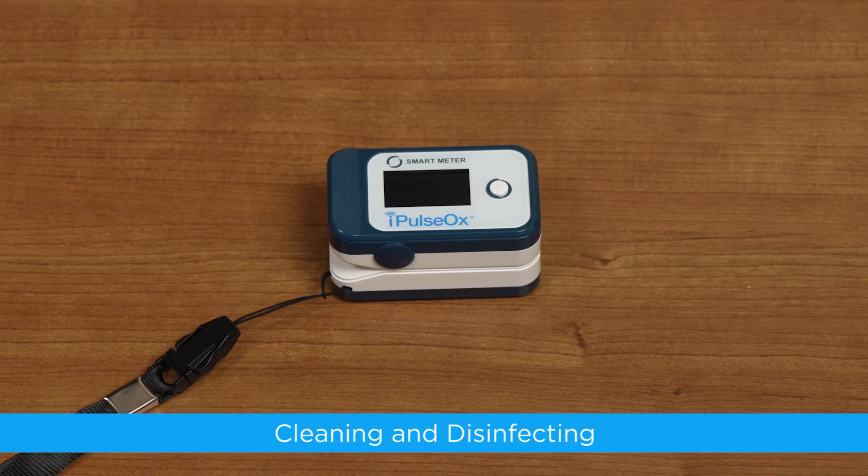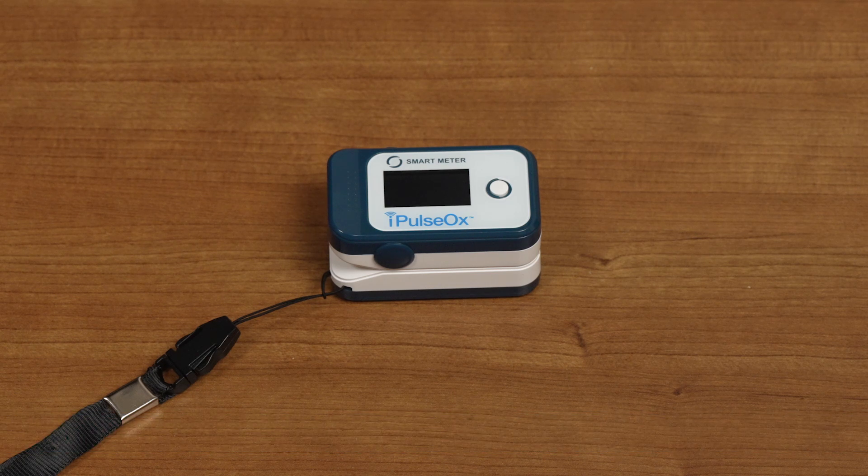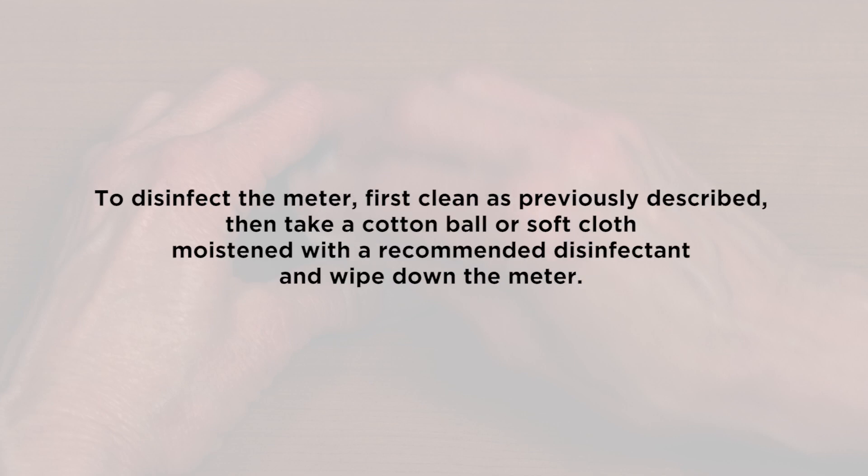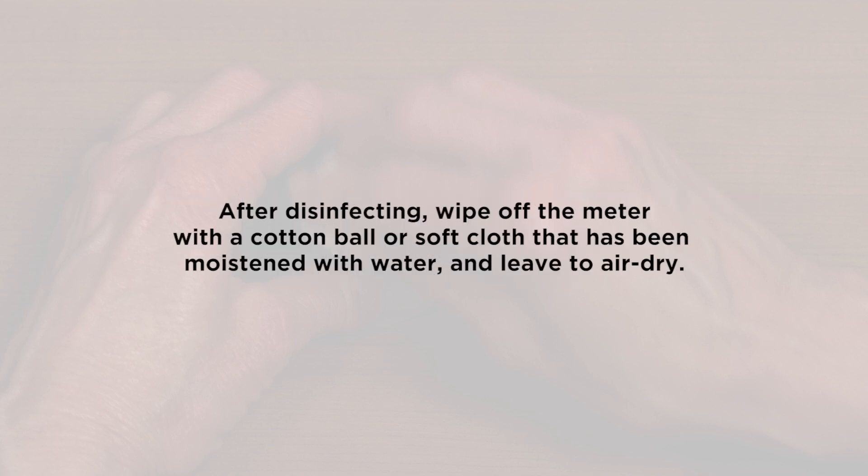Cleaning and Disinfecting. When cleaning or disinfecting your I-Pulse Ox, do not immerse the meter in water or disinfectant. Clean the meter with a cotton ball or soft cloth. After cleaning, dry the I-Pulse Ox with a soft cloth or let it air dry. To disinfect the meter, first clean as previously described. Then, take a cotton ball or soft cloth moistened with a recommended disinfectant and wipe down the meter. After disinfecting, wipe off the meter with a cotton ball or soft cloth that has been moistened with water and leave to air dry.